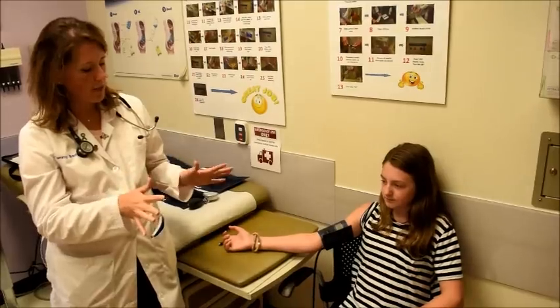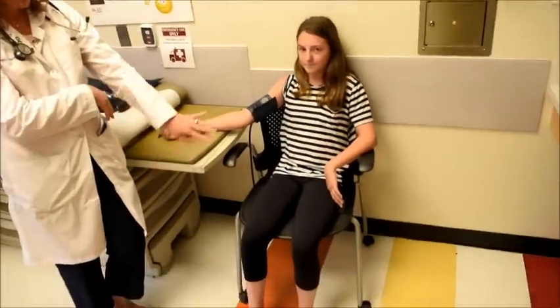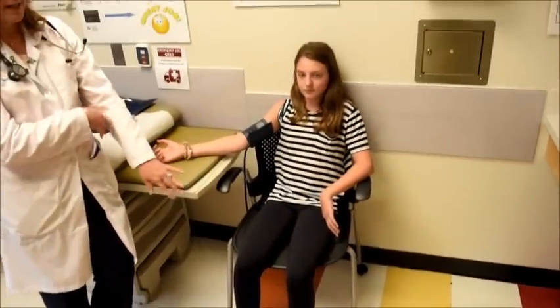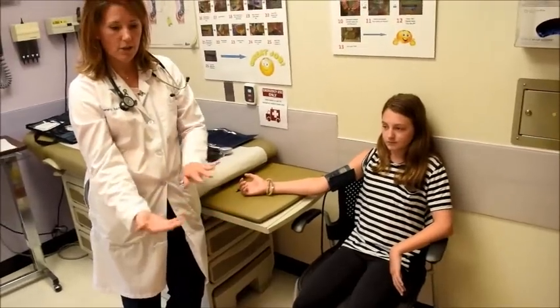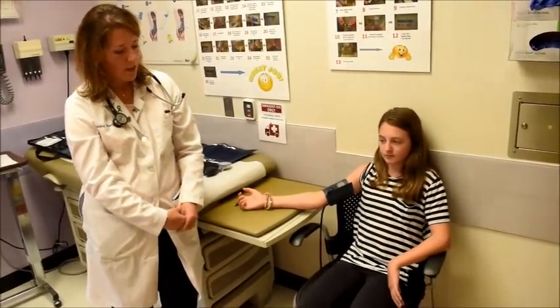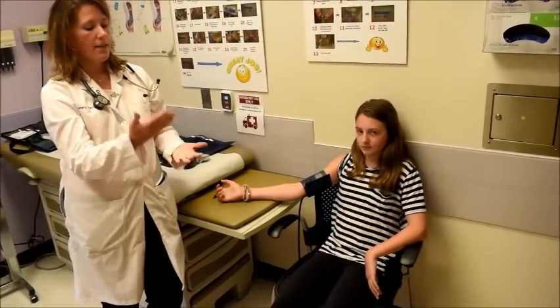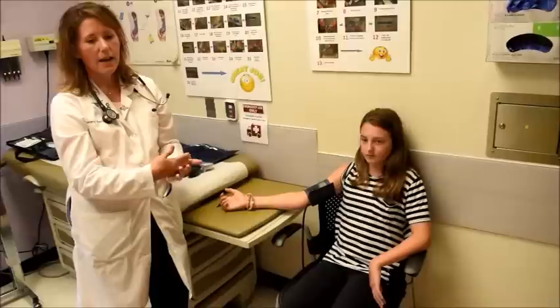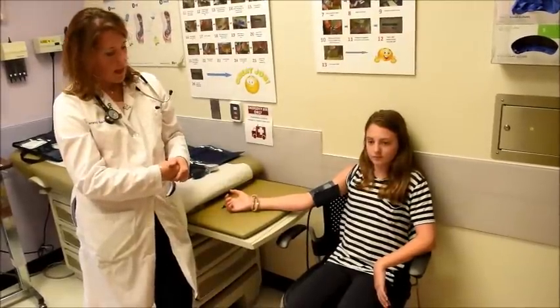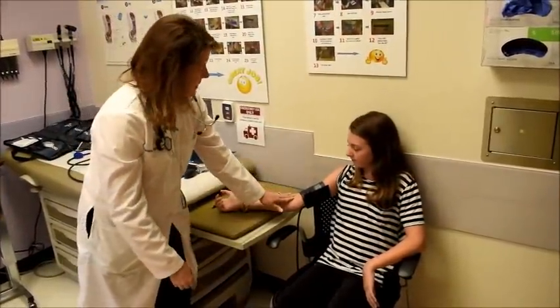And so essential parts of this, you want to make sure the back is supported and that their feet are supported. If you happen to have somebody who's short and their feet are sort of dangling, you're going to want to make sure you put something underneath their feet so that they are in fact supported. You want to make sure their legs are not crossed. You want to make sure, again, that they've come in with an empty bladder.